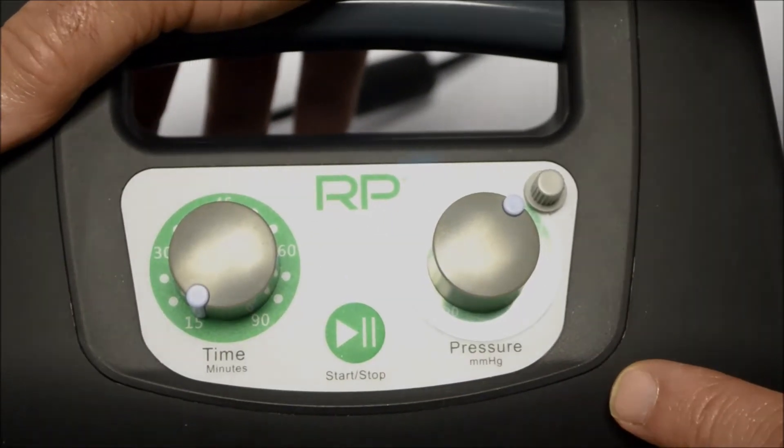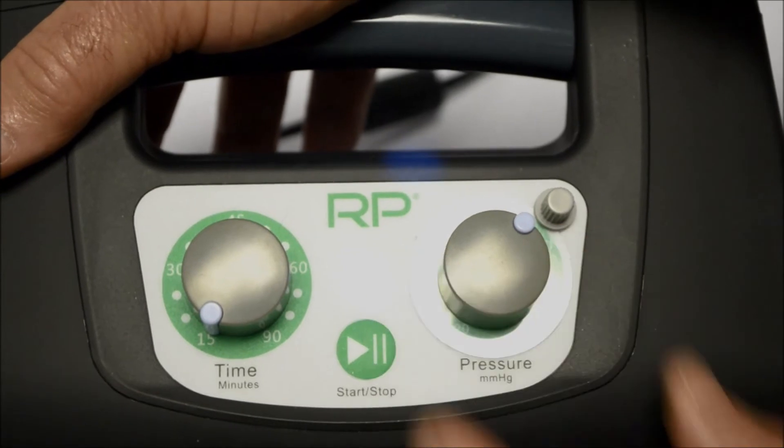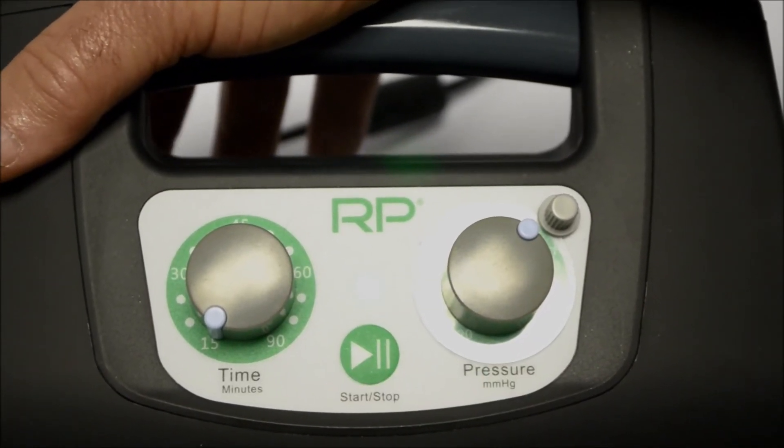You simply turn the switch on in the back, set your time, set your pressure, push start, sit back and relax.